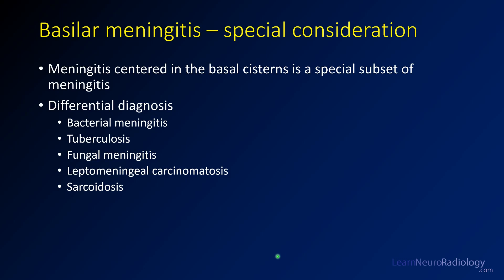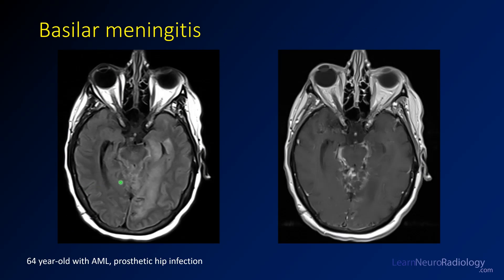Basilar meningitis is a special subset centered around the basal cisterns and sylvian fissures. It has a slightly different differential — while it can be seen with standard bacterial meningitis, you must also think of tuberculosis, fungal meningitis, leptomeningeal carcinomatosis, and sarcoid. This case shows abnormal FLAIR in the ambient cistern, quadrigeminal plate cistern, and surrounding medial temporal lobe tissue. On post-contrast imaging there is avid enhancement, including enhancement of the superior cerebellar folia. That is the hallmark of basilar meningitis requiring a broader differential.